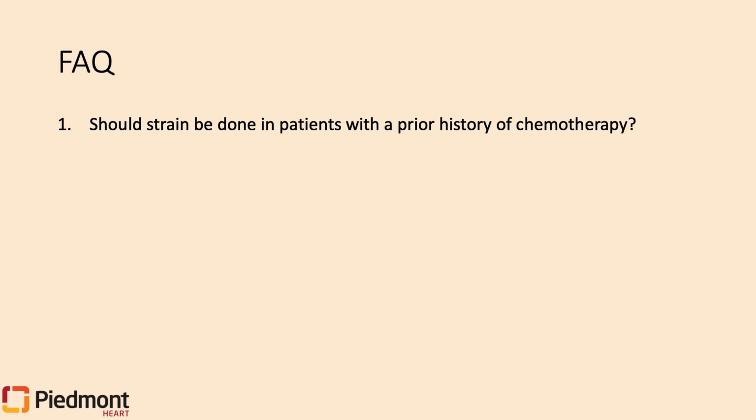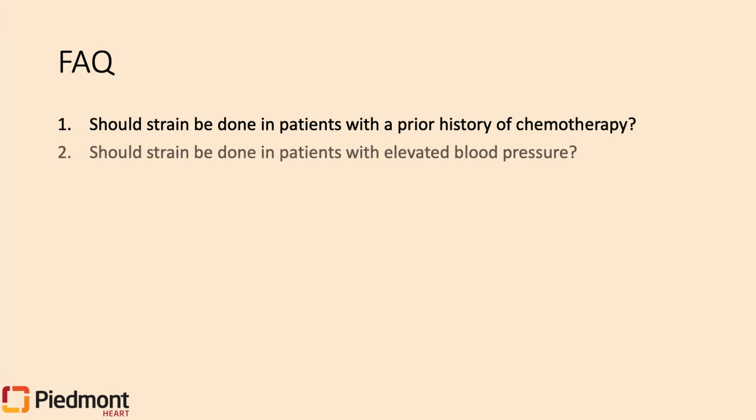So a shorter answer to your question would be yes, get strain if you can on any patient with a history of chemotherapy, as you don't know if this is something that still needs recurrent monitoring or if they are unfortunately needing to restart treatment, you have a new baseline. So if you are able to get the windows, go ahead and get it on these patients, but remember at bare minimum to get strain on patients who are about to start chemotherapy or actively undergoing chemotherapy.